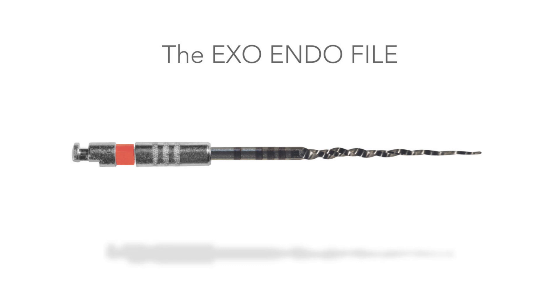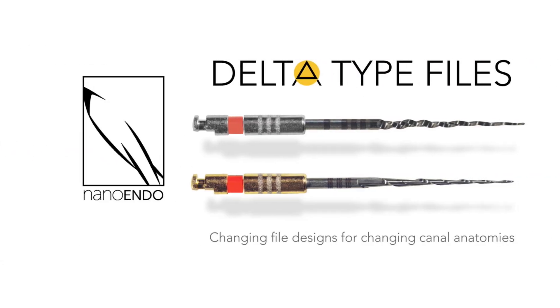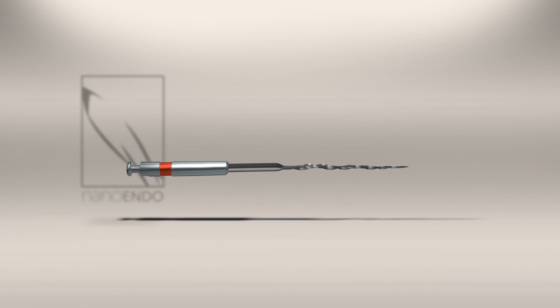The second file in an entirely new category of endodontic files. With its increased flexibility and unprecedented efficiency, the exoendo file is the perfect complement to the well-rounded features of the one endo file.